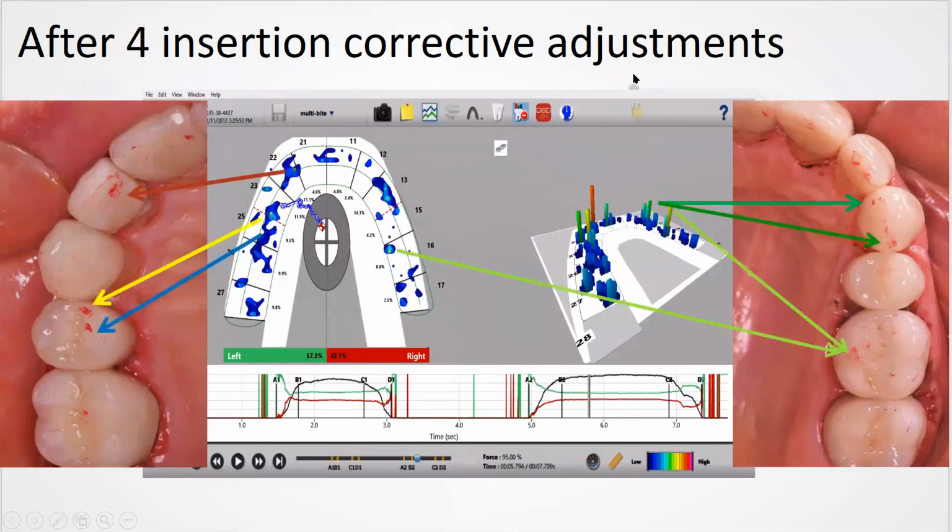So again, we map it. And notice that this arch has only 1 premolar, and we've customized the arch, which you can do with the T-scan. We've taken out one of the premolars, so we jump from the 2.3 to the 2.5. Now, I want to show you this area because it's actually very telling. These marks are virtually the same color. This one is a little bigger, this one is a little smaller, but in terms of their mark intensity, they're virtually the same. And the question becomes, how would you know which one to adjust when looking at them?